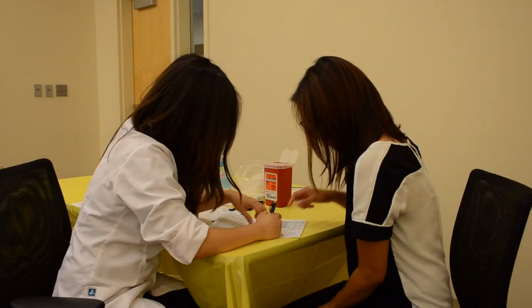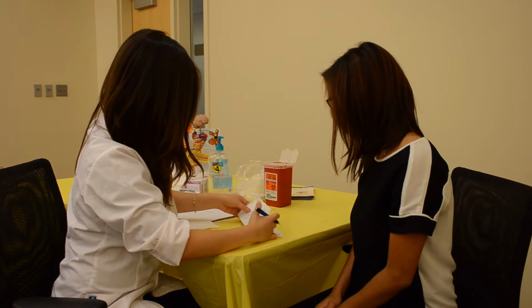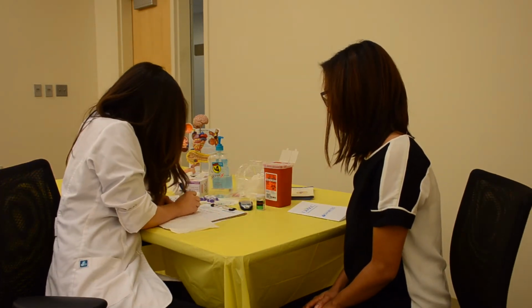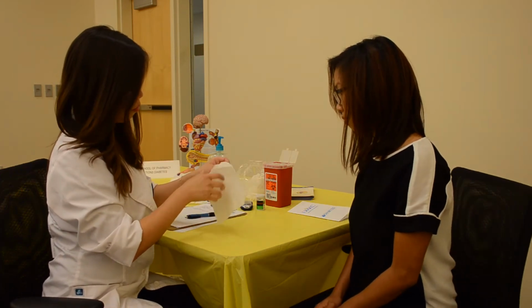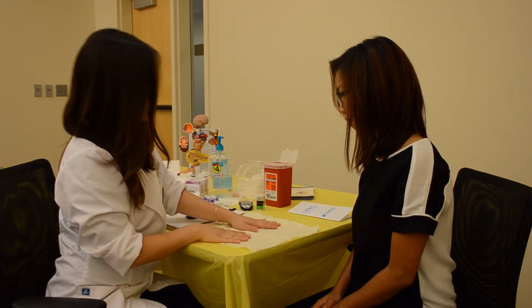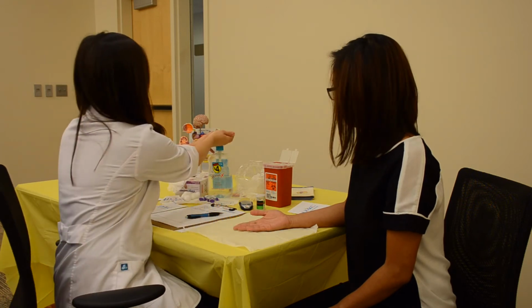Now we are going to demonstrate the finger stick. Let the patient know what you are doing to them before you do it. Let them know that you will now need to obtain a blood sample in order to check their blood sugar. In order to do that, you will need to prick their finger. Let them choose which hand they'd like to use. If they don't care, choose their non-dominant hand.